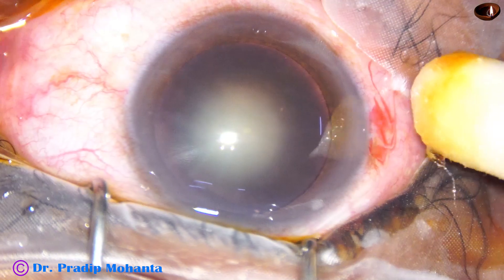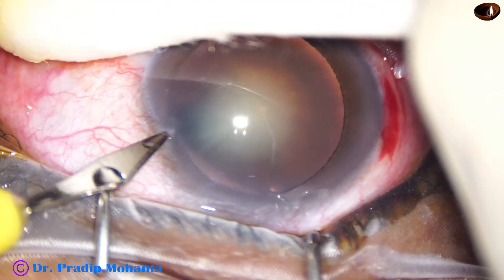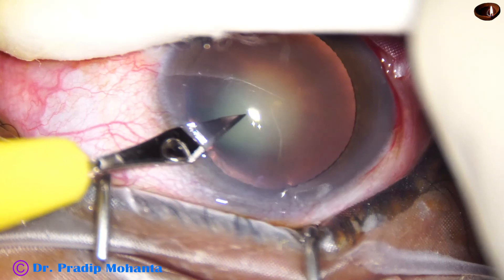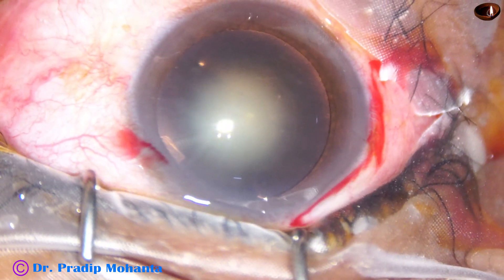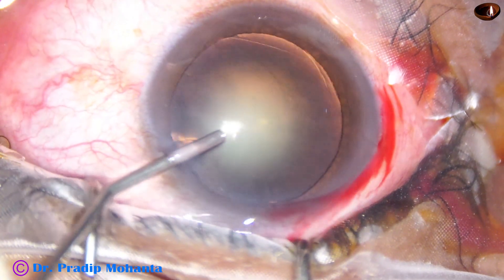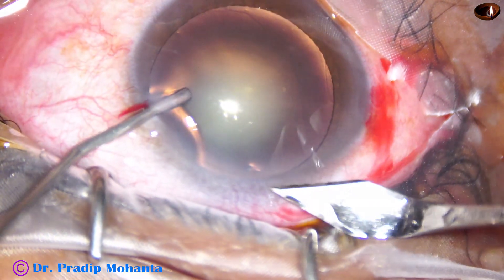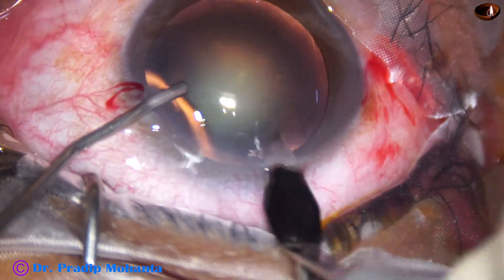This is the right side port and this is the left side port. The main incision is not yet constructed. Now he takes visco, fills up the antechamber through the left side port, fixes the eye by the same cannula, and does the main incision.